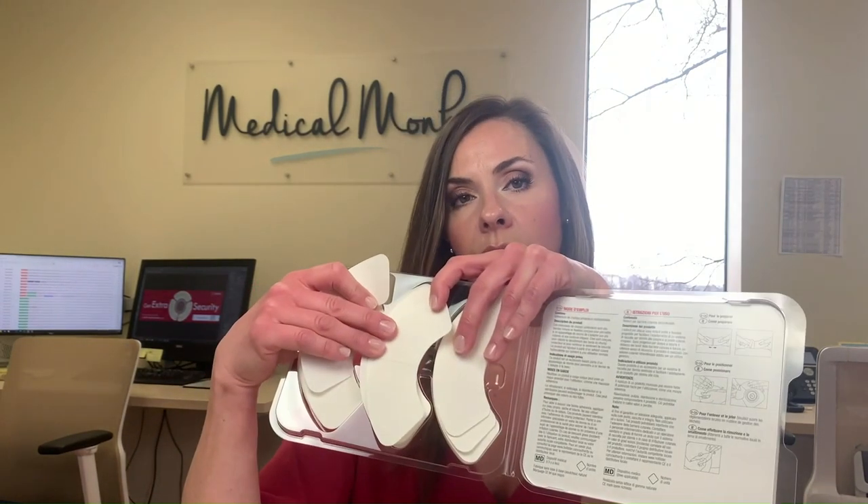The interesting thing about these is they come in three pieces, so you can actually decide where on your stoma you're going to want to put them. You don't need all three if you only need one, and we're going to talk about that in a little while and show you how to use them.